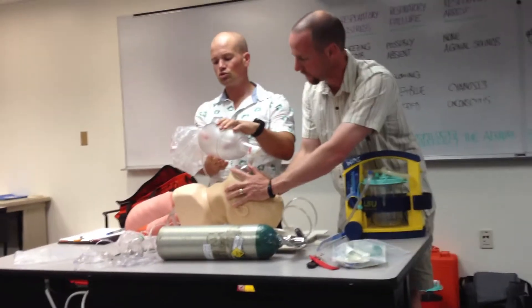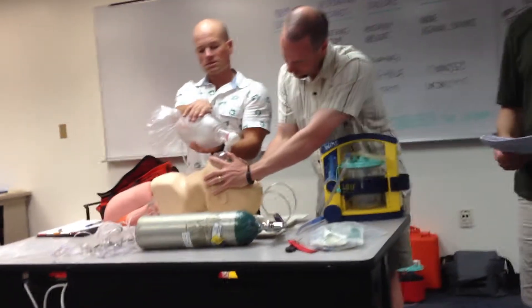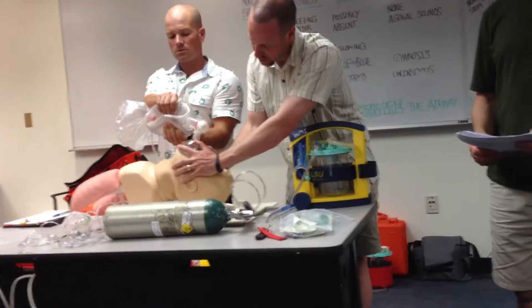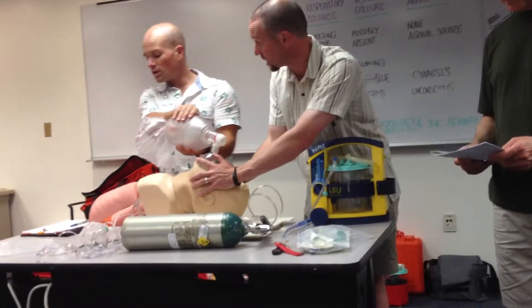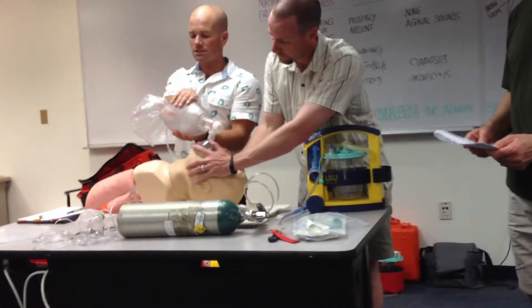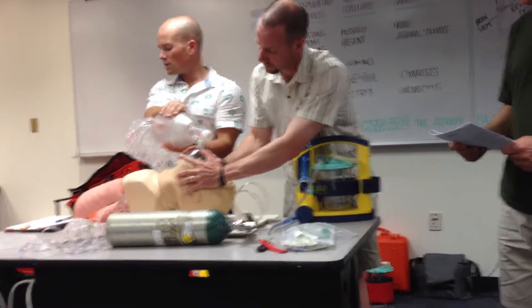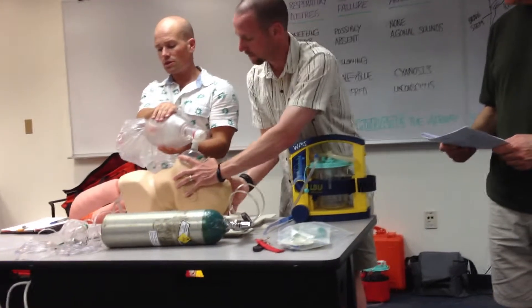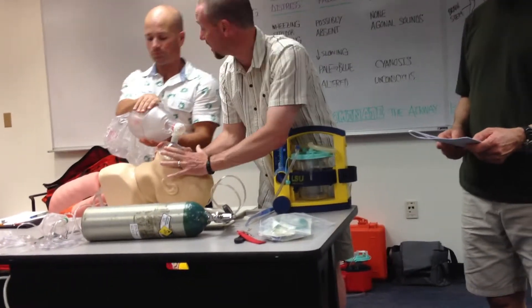We're going to slow down a little more — two, three, four, five, six, seven. We can just see the chest rise and actually get a good long inflation. That's a little too fast there, sir. Can you slow down a bit? Let's go with every six or seven seconds.